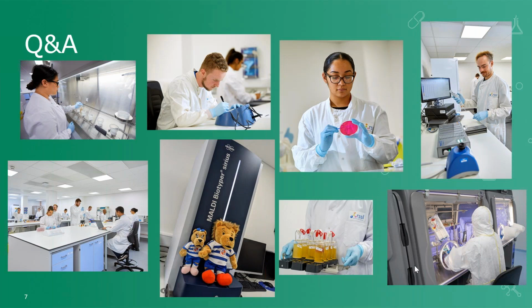Okay, I've got a couple of questions about the mycoplasma. Anne Len has asked, can the mycoplasma test be a rapid test in a release testing of GMP product? Yes, it can do, because there are general requirements within the European Pharmacopoeia, because that would still fall under the rapid microbiological substitution method.